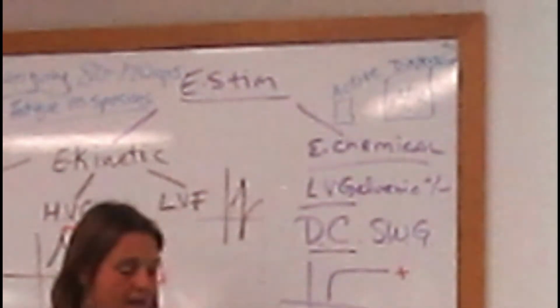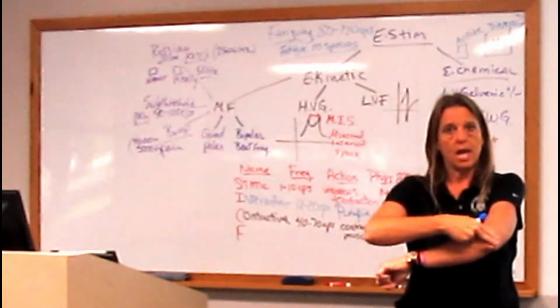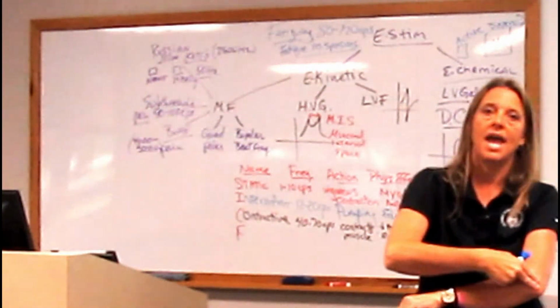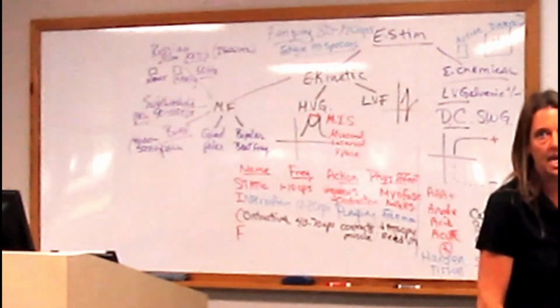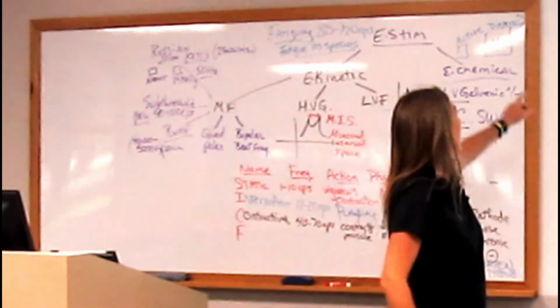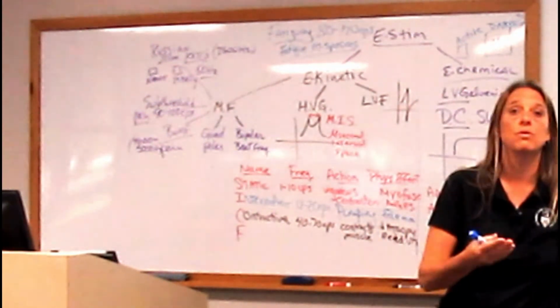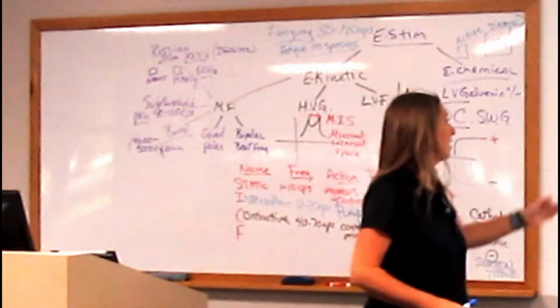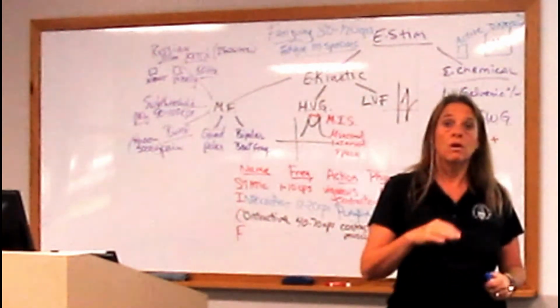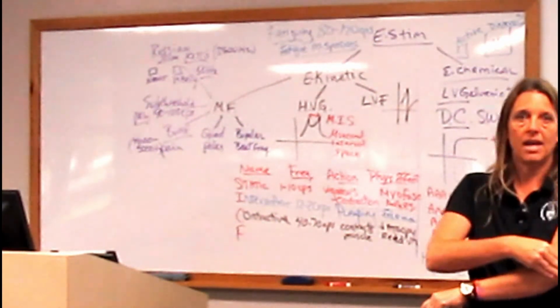This is so that you put the active pad on the injured area, my elbow, my lateral epicondylitis, and the dispersive pad somewhere big where it doesn't tickle, low back, thigh, bellies don't work. And it's an acute elbow problem, so we'll use the anode. So we'll set the DC setting to the positive, and we'll put it on the little pad on that area.